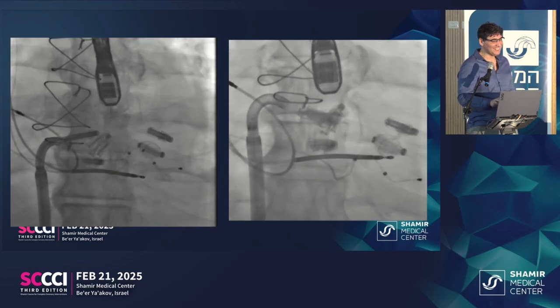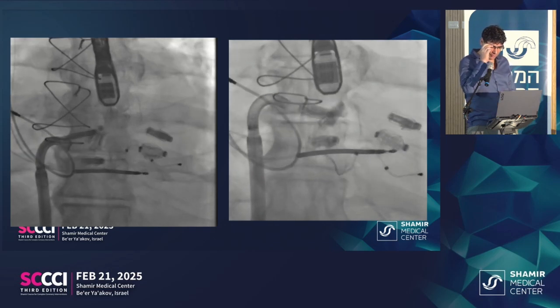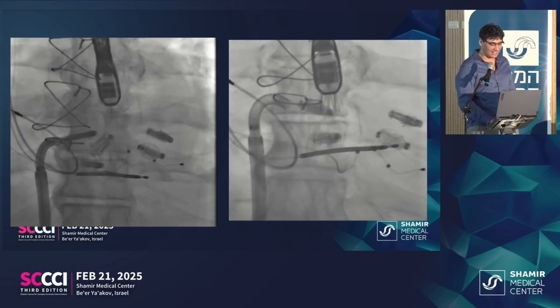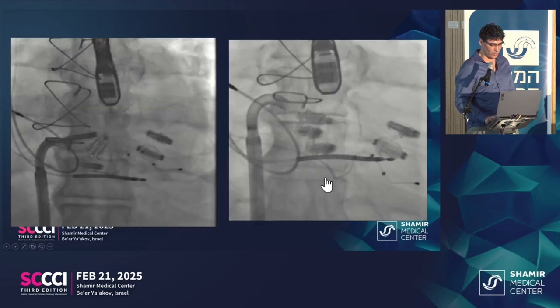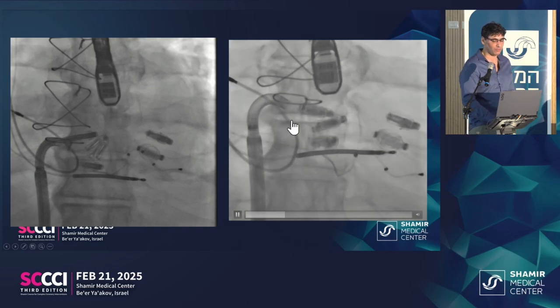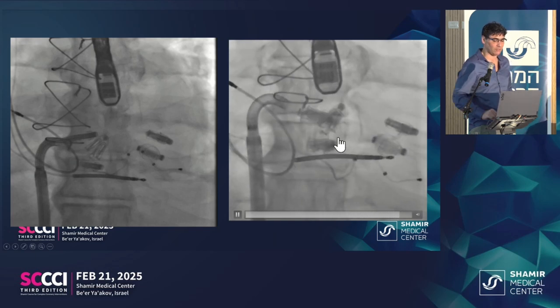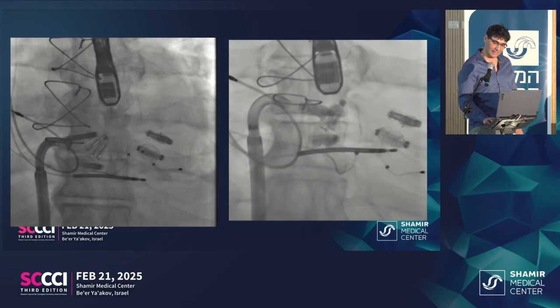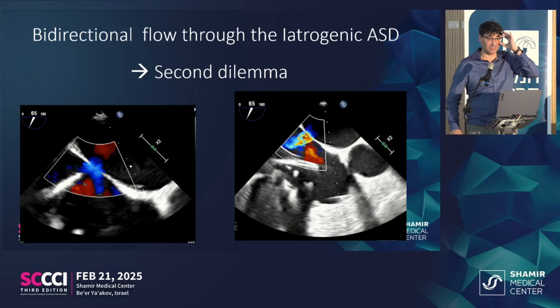What we do have is, and this is the reason I wanted to call it a party in the atria, if you can understand my discotheque. Anyway, after a lot of analysis, what I'll show you again, but basically the first clasp that had a single leaflet detachment is for sure detached, but the one above it stayed quite connected, and it's just the interaction between them that looks so funny. So we said, okay, enough is enough.